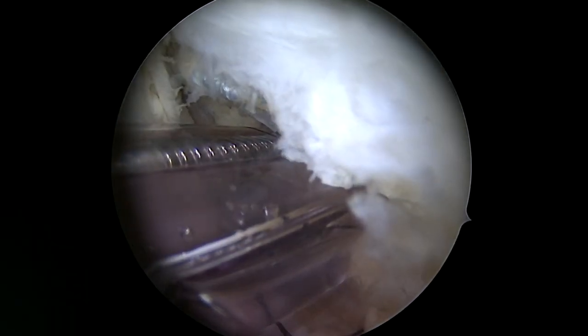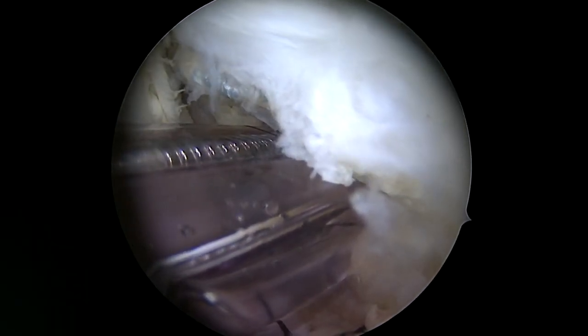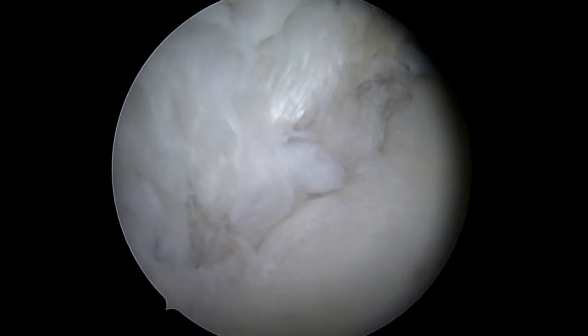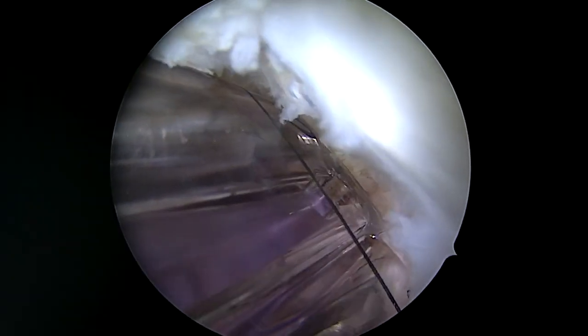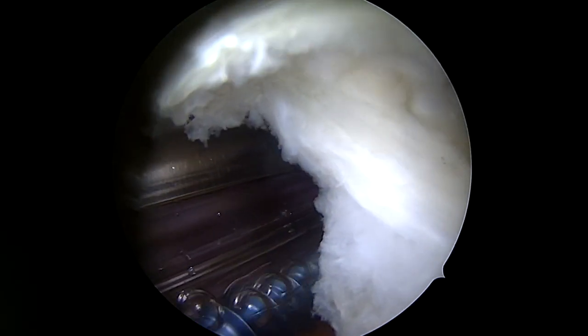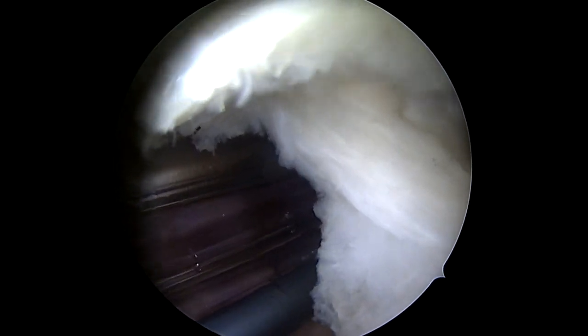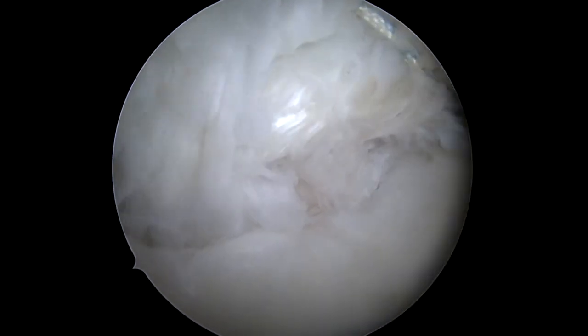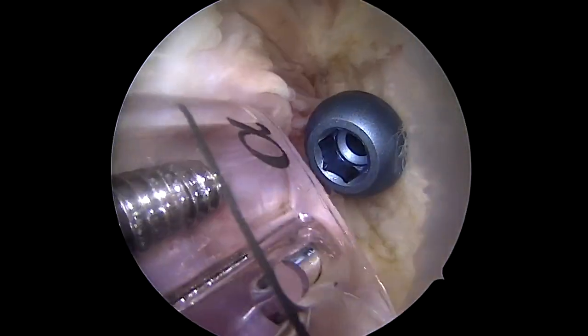From here we place a wire through the drill guide, using the wire to lateralize the piece to where it's supposed to be, then drive the wire through the glenoid and drill to place our screw. The Halifax portal allows a screw trajectory more parallel to the glenoid face, which is really what we want in this situation. You can see how solid the fixation is and how the piece looks like it's in the right spot.